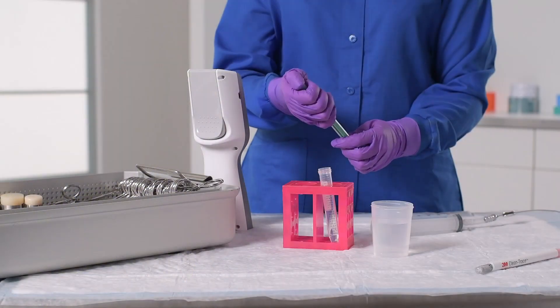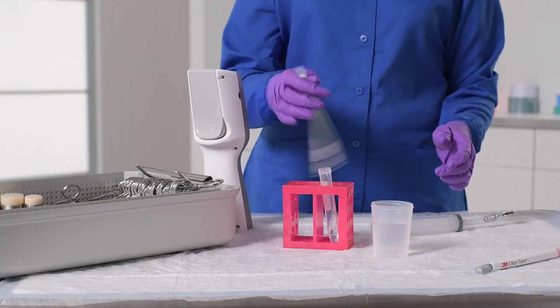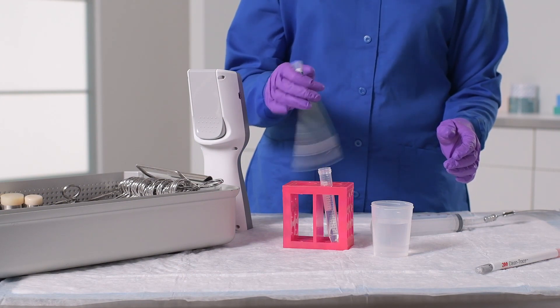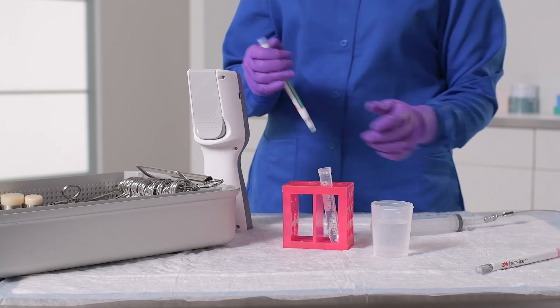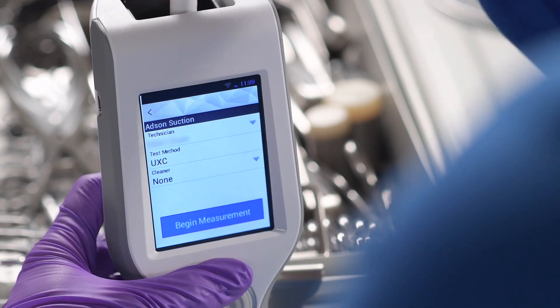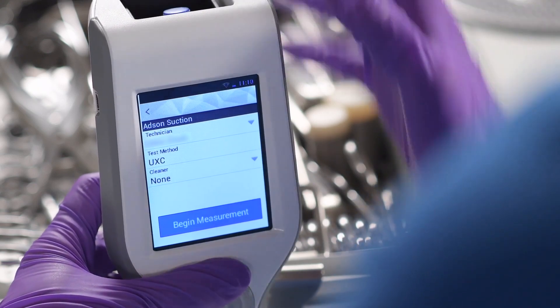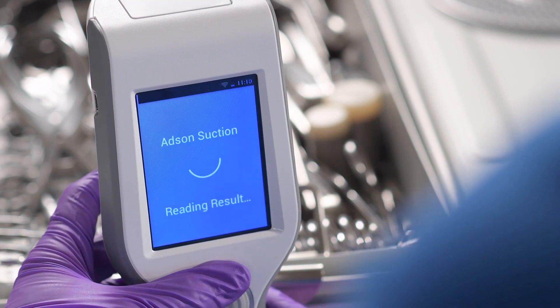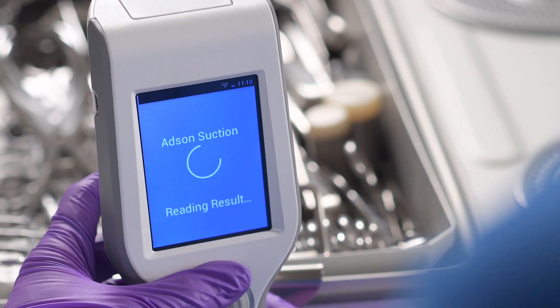The CleanTrace system uses an enzyme that converts ATP to light, invisible to the naked eye, but easily read by the CleanTrace Luminometer LX25. The result is expressed as a relative light unit, or RLU, which represents the amount of clinical soil on the surface or device.